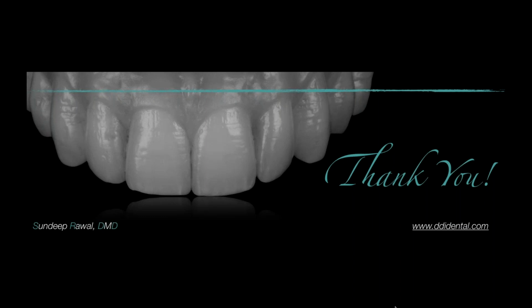The key is when we do a digital smile design and we create that virtual wax-up, I don't want to just blindly follow it. And that's why we always do that motivational mock-up, where, based off the digital wax-up or virtual mock-up, we'll print a 3D model, make a matrix, and we will do the mock-up in the patient's mouth to show them what the new tooth shape and form will be so that we get their approval ahead of time.